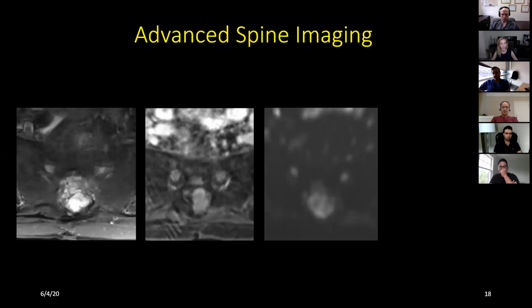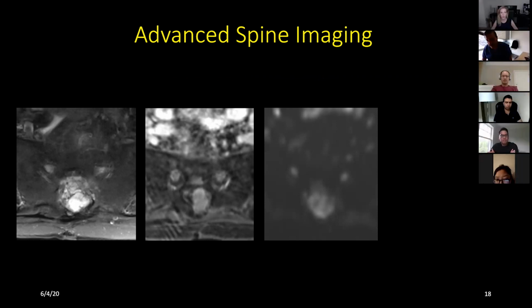Just like with brain tumors, diffusion imaging has become such a pillar of evaluating brain tumors that you are now triaging the patients or even telling whether it's a grade 1 versus grade 4 based on what you are seeing on your diffusion and perfusion imaging. So we thought that we can extrapolate the same data and put it into the osseous spine also and see what it does. I'll say that this is still a work in progress for us, but we are seeing some exceptional results with this.